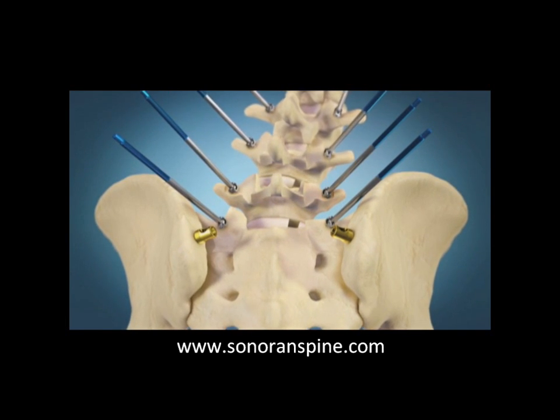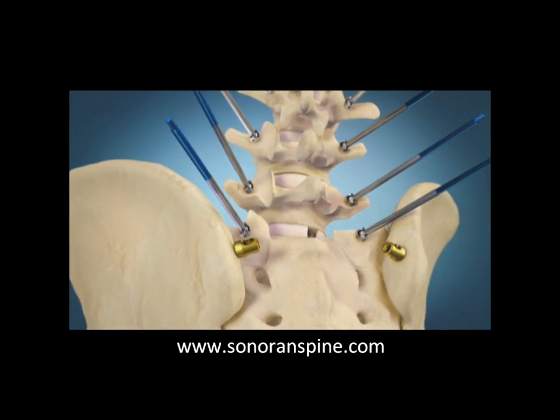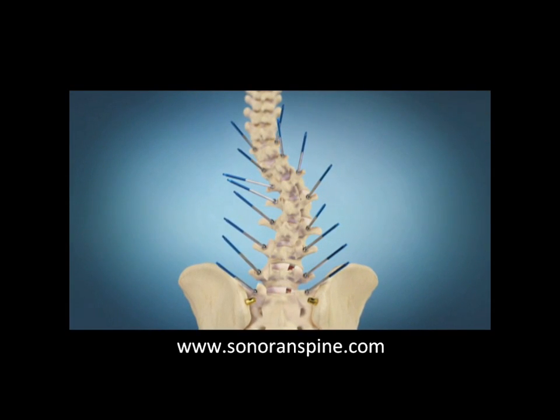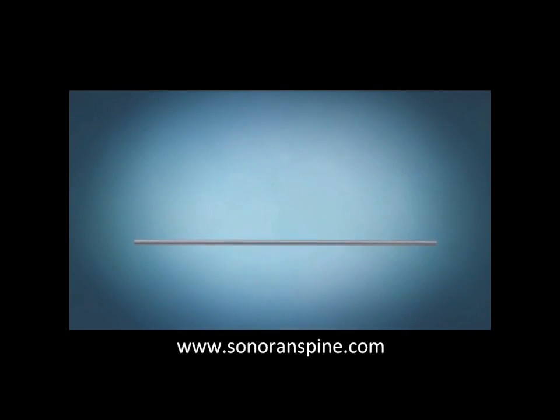What we're showing here is the results of interbody fusions with an interbody cage placed eccentrically toward the right side to help level those lowest two vertebral segments.